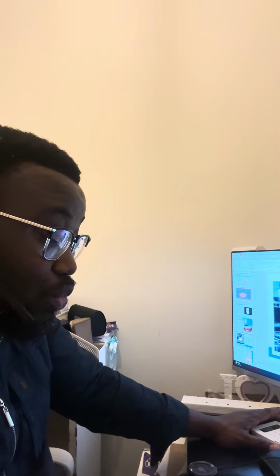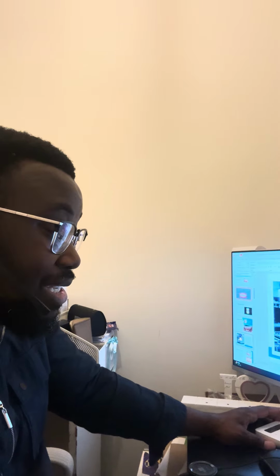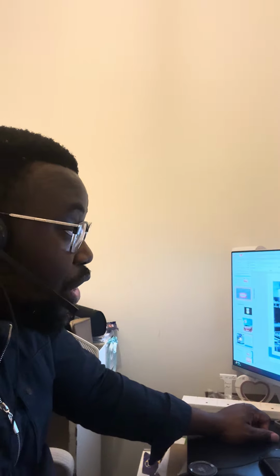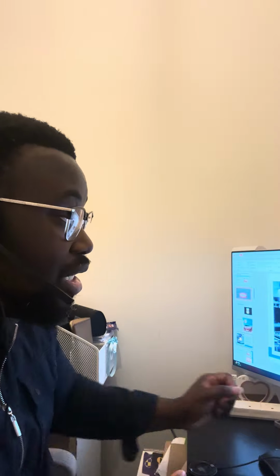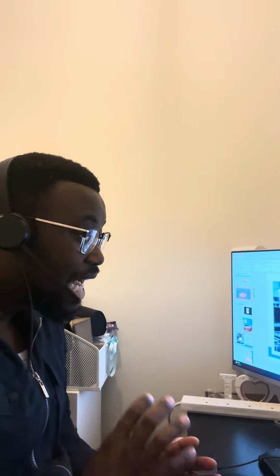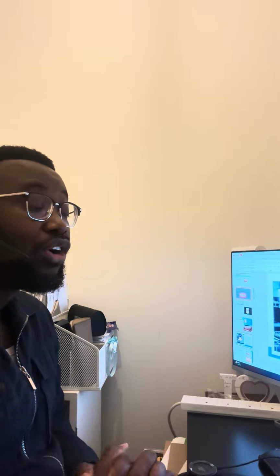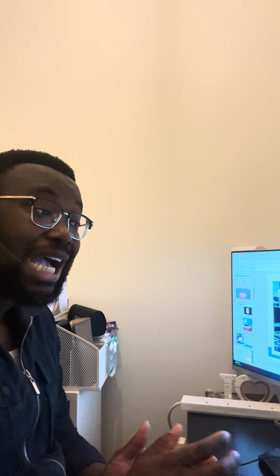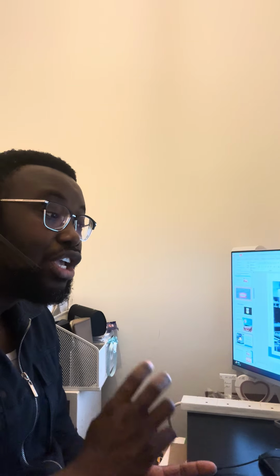Okay, and it has worked significantly well, and this is the future of digital denture. This is the future of denture production. So we say that with 3D printing, dentures can be fabricated using digital models, allowing for greater precision and customization. So this eliminates human error. Okay, at the printing stage, it eliminates human error.